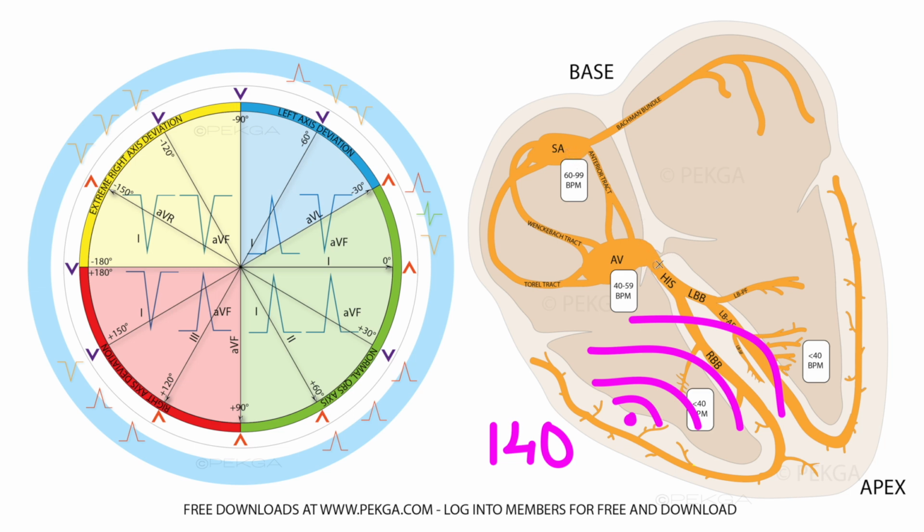But this signal is not penetrating the atrium, and the atrium is able to conduct signal at a slower rate. But the ventricle, this little point right here, is what's driving the rhythm. That is ventricular tachycardia.